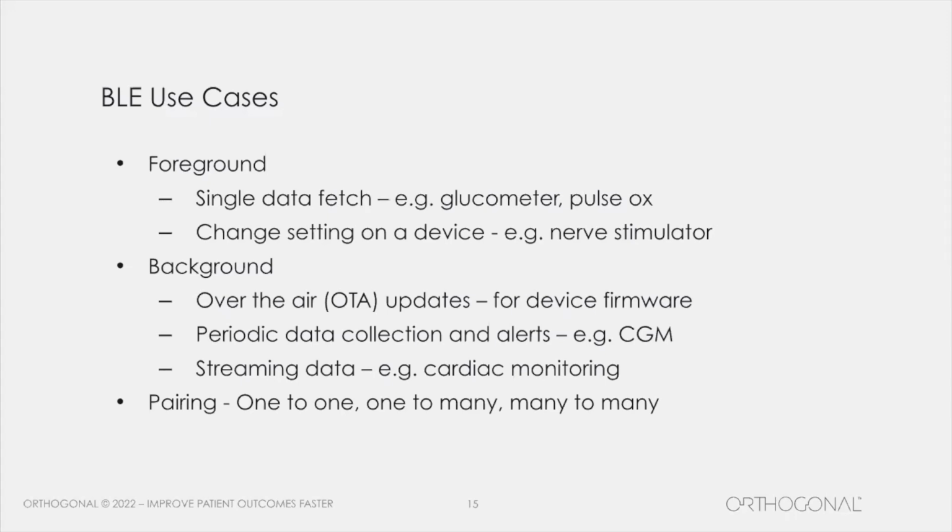You may end up in a situation where you have many devices and many smartphones. So, for example, if you are implanting something in an operating room, there may be a lot of devices that are already on, and you want to be able to pair to the correct one. If there are 20 devices sitting there and 20 smartphones, you have some interesting challenges in that regard.